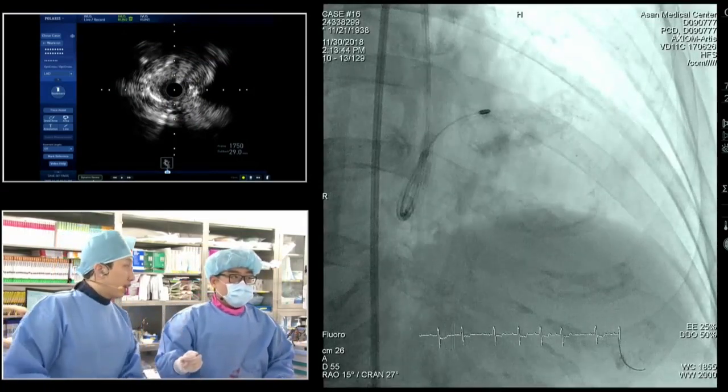Shall I show you the LAD? So we're going to move to another cath room. Dr. Kim. Okay, let's go to the diagonal branch.